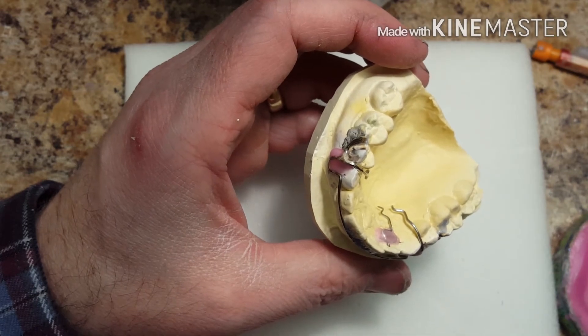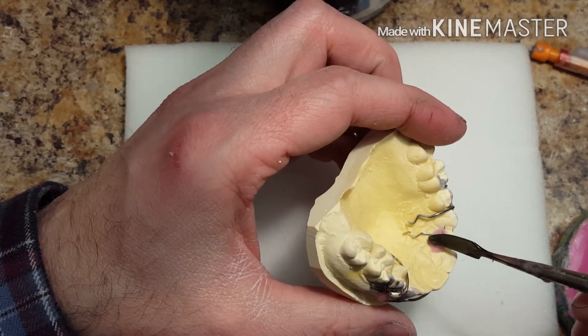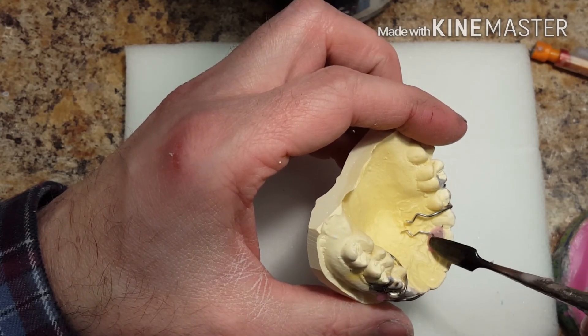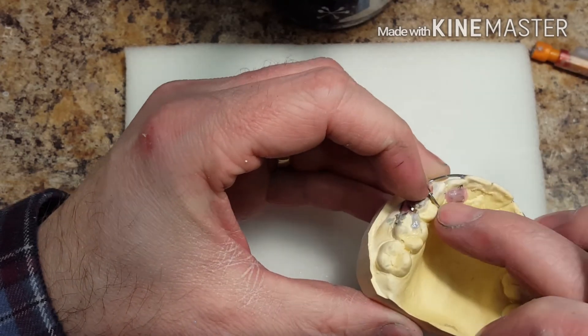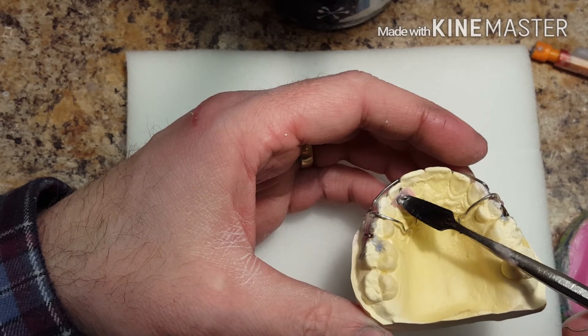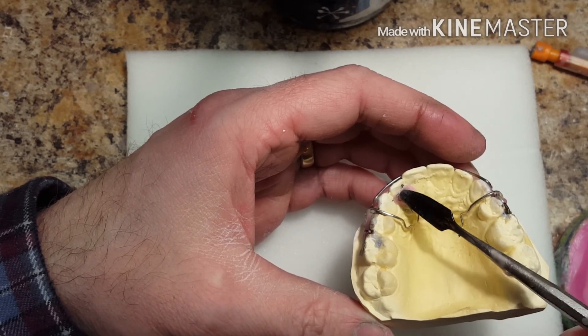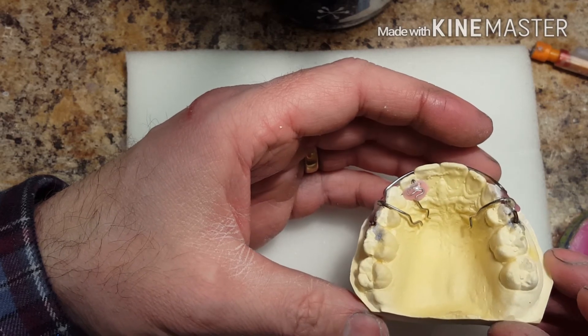This also prevents the spring from being bent by the patient. You'll see in the final product that the spring has a covering over it — like a little sheet of acrylic. That's also going to prevent the child from playing with it with their tongue or finger and bending it.